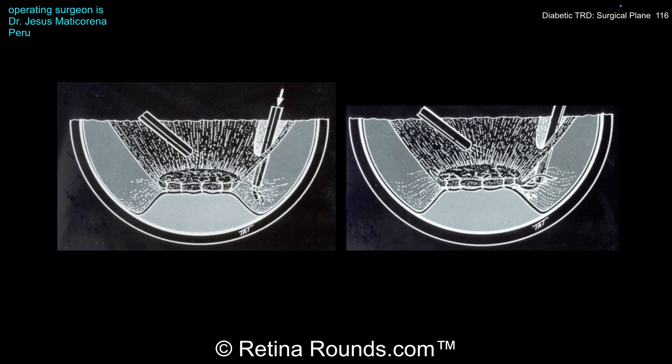Both during and once the dissection is completed, remember to address any oozing vessels with diathermy or laser. PRP should be done anterior to the equator and up to the ora, avoiding laser to areas where the retina is detached. Assuming no retinal breaks are present, any residual fluid will slowly resolve over time — this can take months due to the thick nature of the subretinal fluid. Posterior fill and PRP, if needed, can usually be applied in the clinic easily.